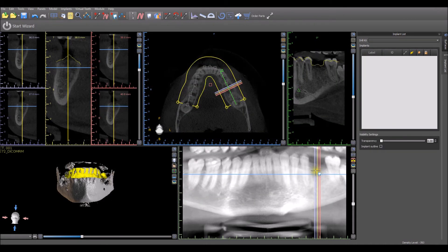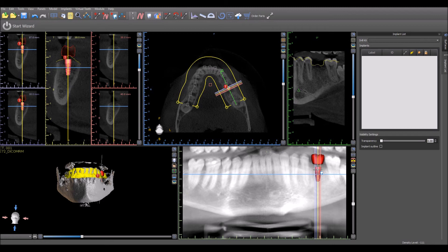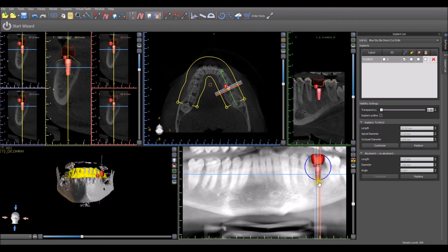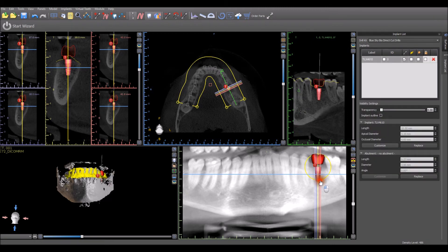Drop the implant into the treatment plan and modify the placement accordingly.